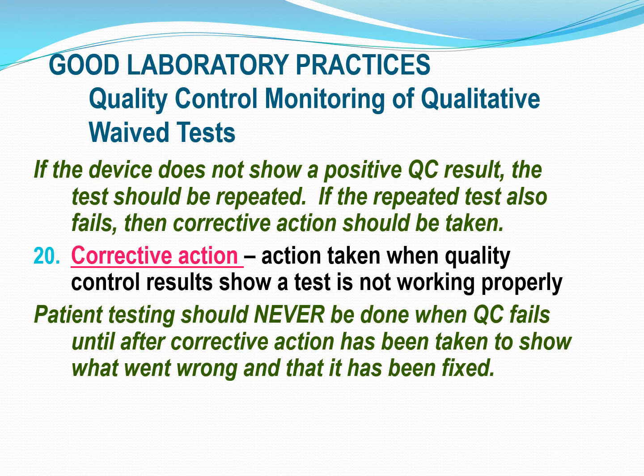So let's just say there are only a few strips left in that vial of strips that you were using for that particular glucose monitor. And you looked at it and they were really close to being expired. They weren't expired and there were still a few in there, but you've got to remember, moisture from the air each and every time you open those strips gets into that strip and can damage those strips. So as you're opening and closing them repeatedly over time, when you get down to the end, very possibly it could get to the point where they're not working properly.